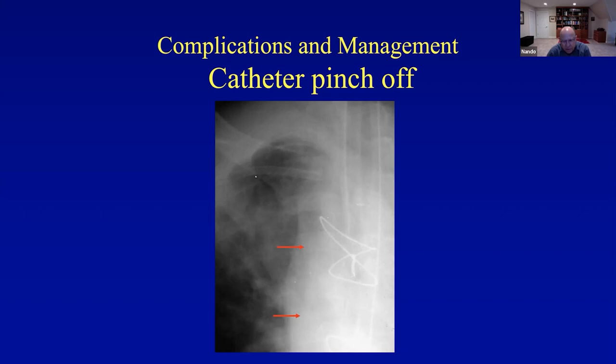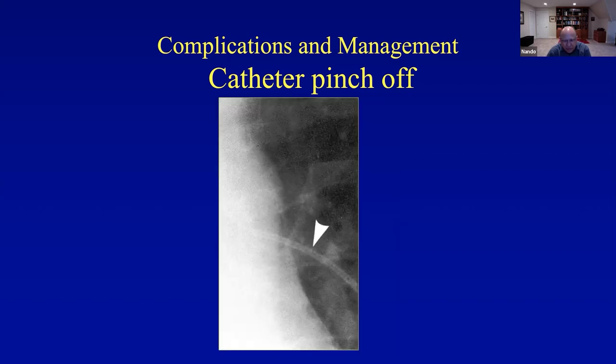At that point, there's a huge sinking feeling, knowing that this catheter could only have migrated through the heart, possibly into the pulmonary arteries. And indeed, you see the catheter in a pulmonary artery in the left lower lobe. At this point, one has to think very quickly, and trying to grasp this catheter through the right ventricle could possibly cause significant arrhythmias, plus the pulmonary artery is probably in spasm around this fragment.